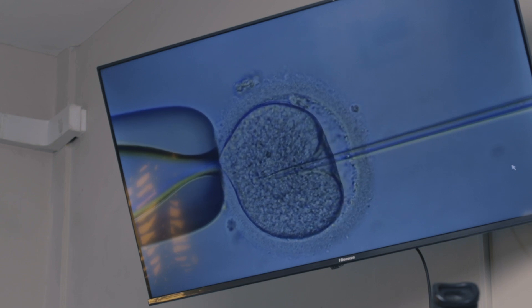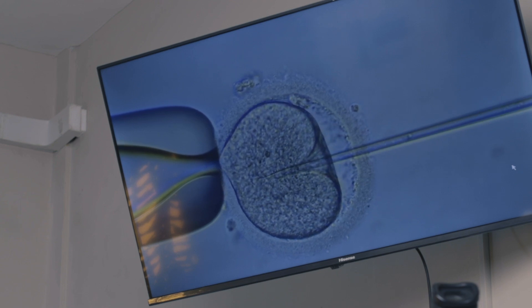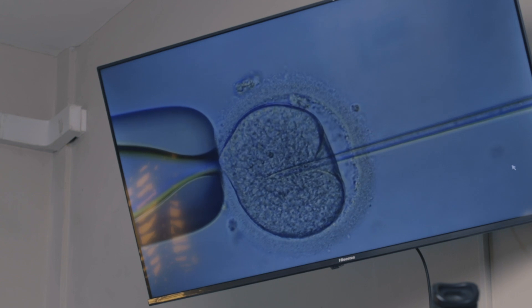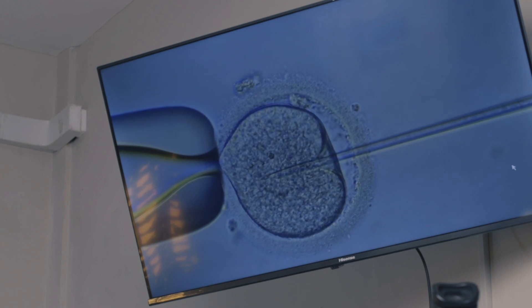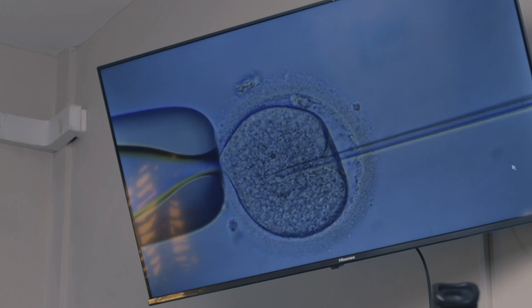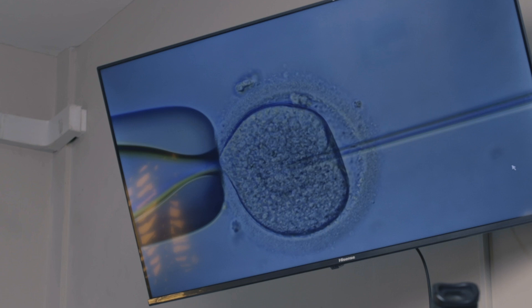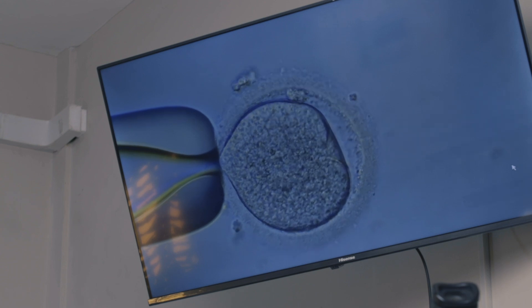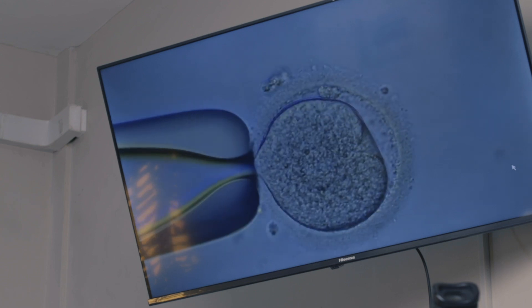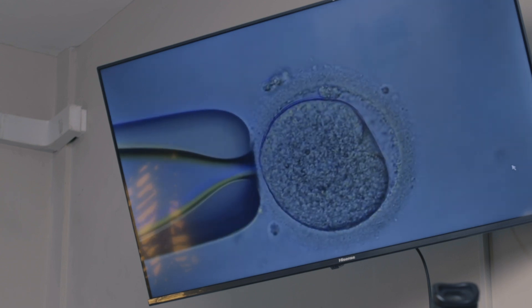Once I do inject the sperm into the egg — all right, that was beautiful.